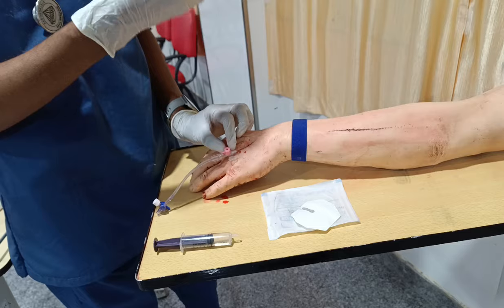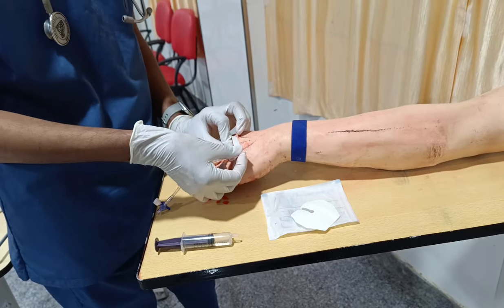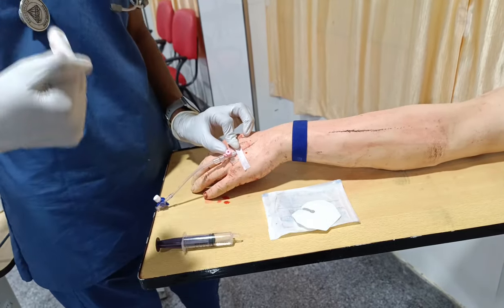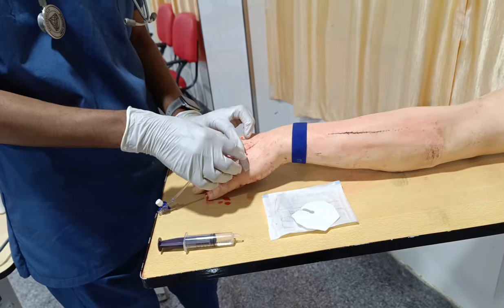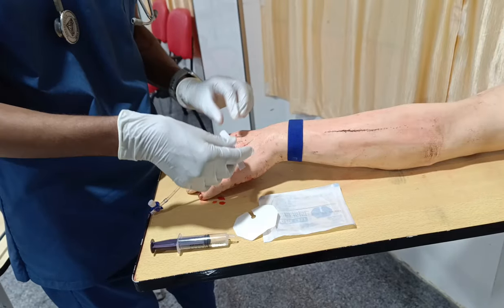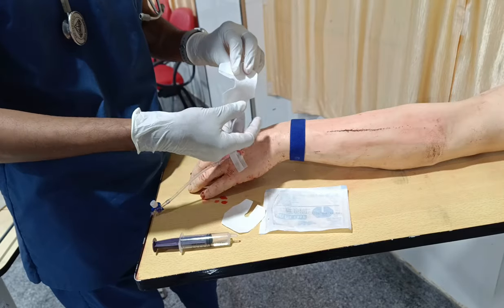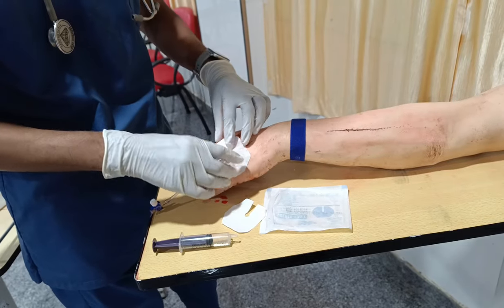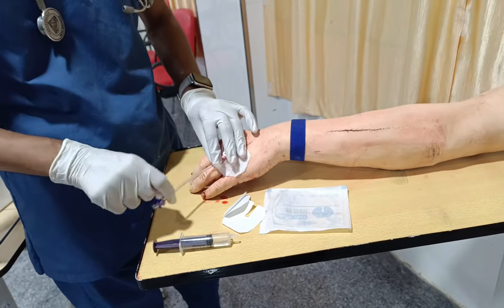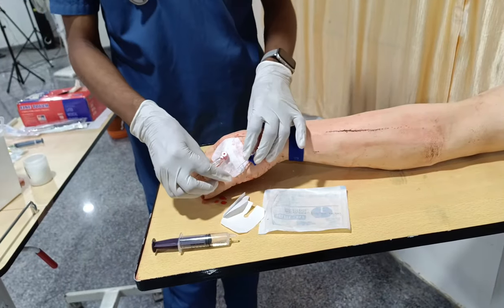To prevent that catheter embolism, we have to place the IV dressing over this region. That is why we keep at least 2 or 3 millimeter exposed to the outside, and you fix it off. Here I fixed it, and the remaining catheter portion I can fix as well. Now I have anchored and secured the catheter. You can place your micropore over here and complete the procedure.